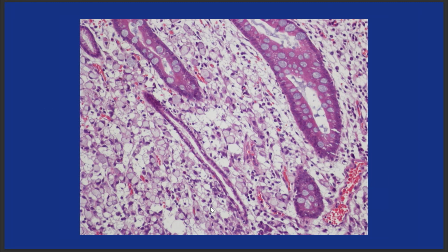And first I wanted to make a parenthesis, because last time that I was here in 2020, we talked about how Dr. Correa described that this cascade was primarily associated with the intestinal type of gastric cancer. But we see that the presence of intestinal metaplasia is not only limited to the intestinal type; there is a big percentage of diffuse type cancers that are associated with intestinal metaplasia. So this is just to show a case of a diffuse type. These are cells invading the stroma, and there are surrounding islands of intestinal metaplasia.